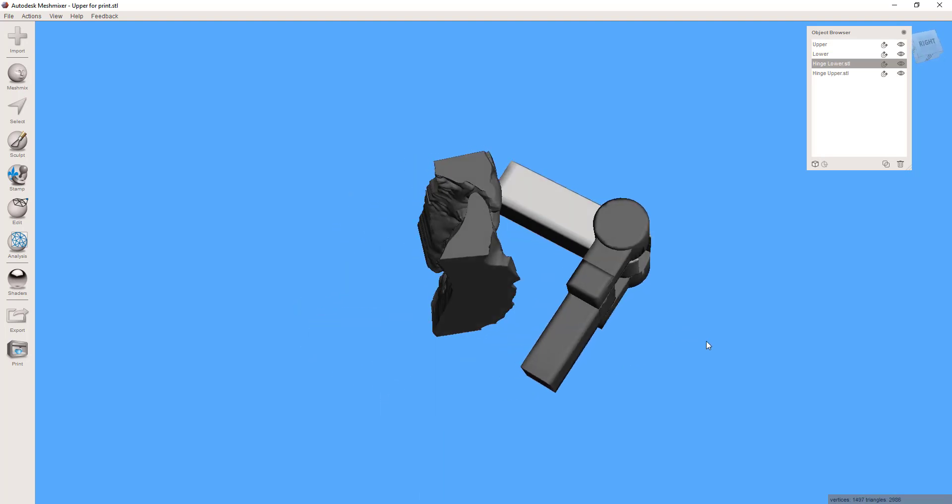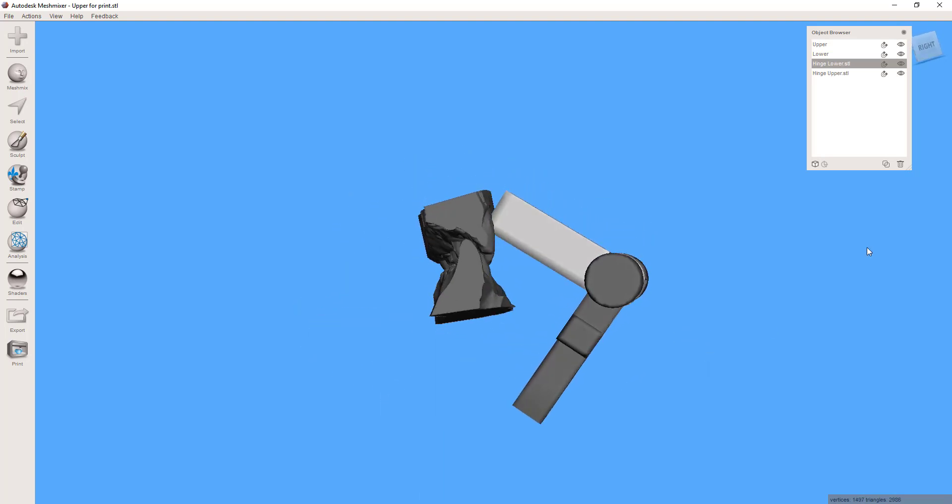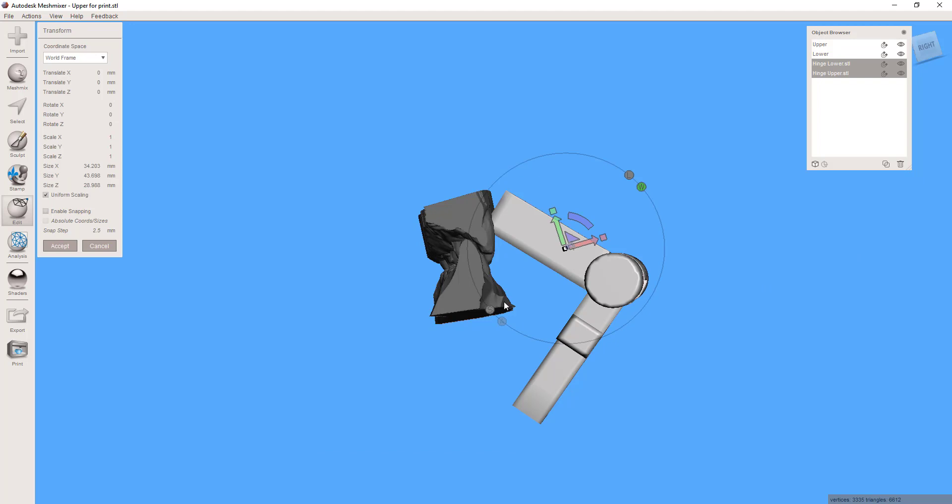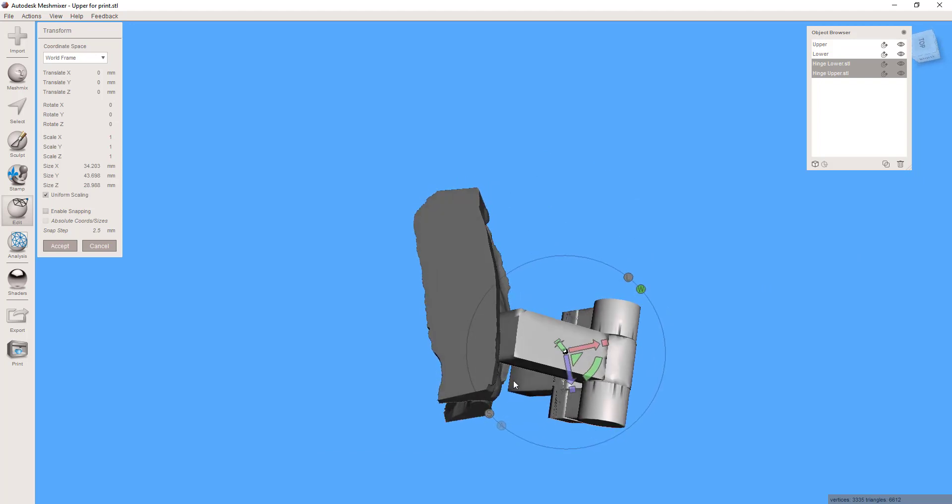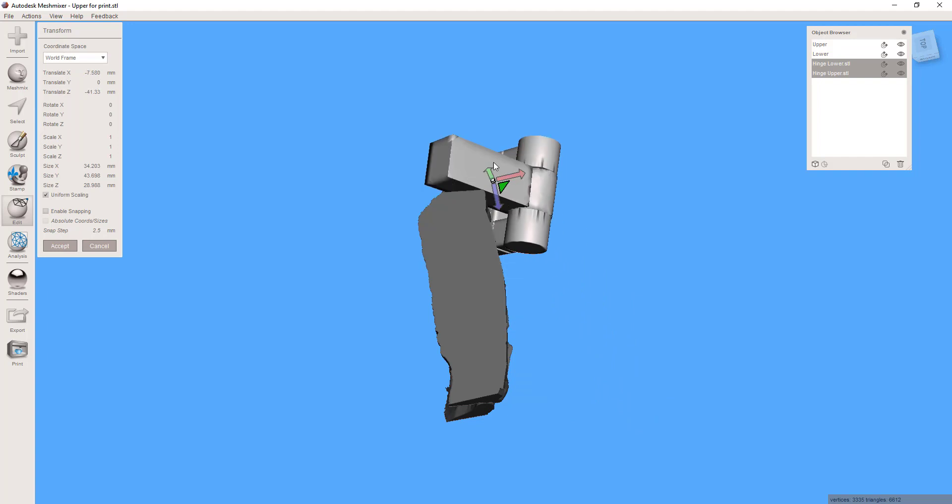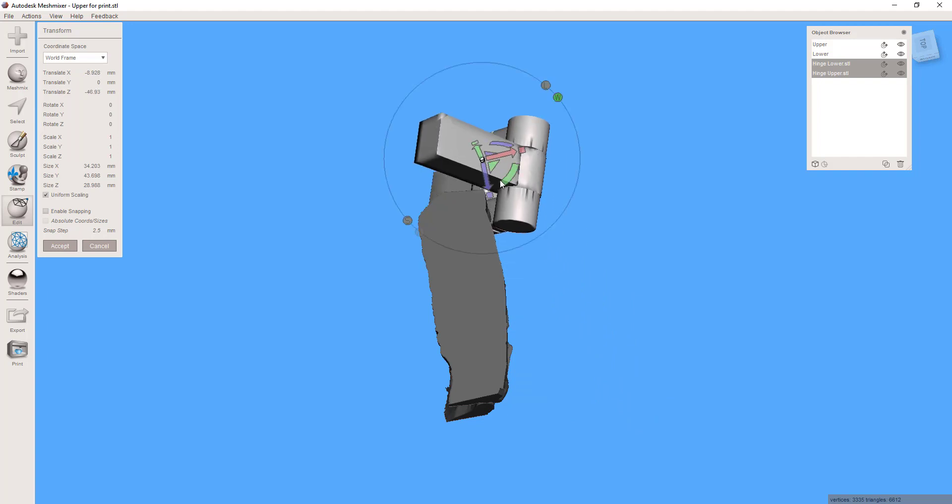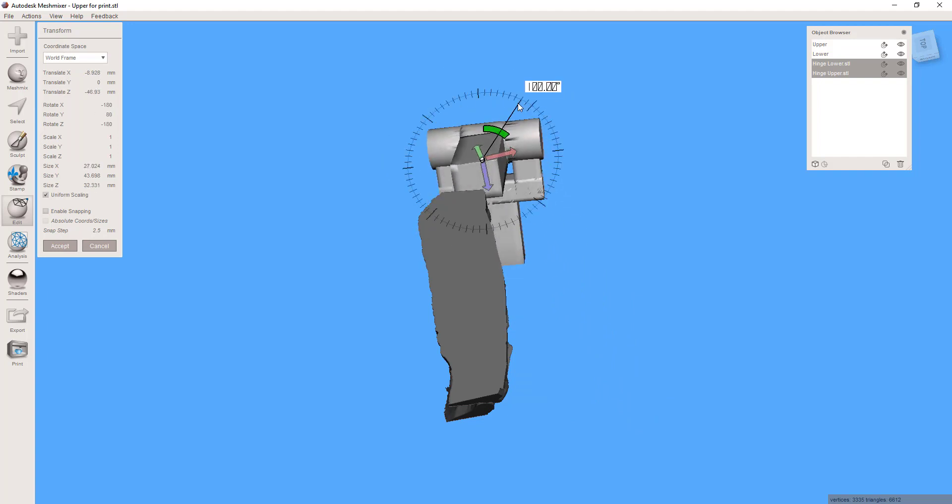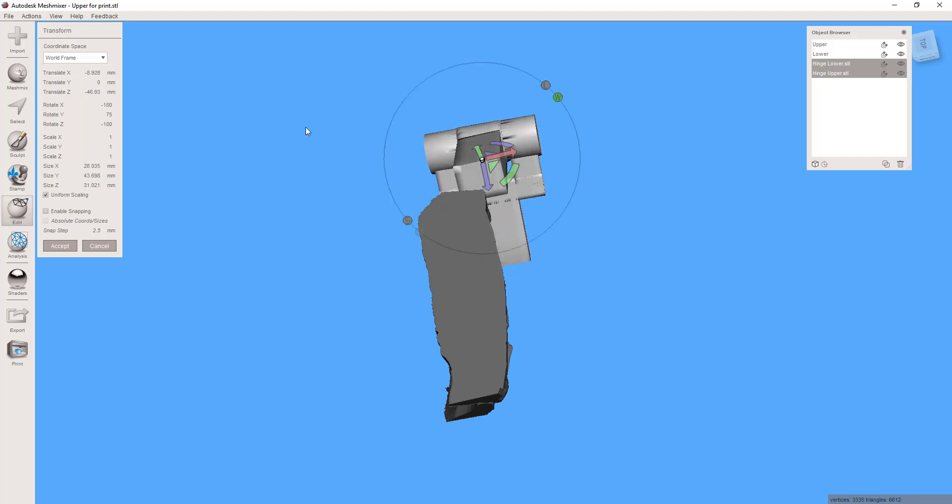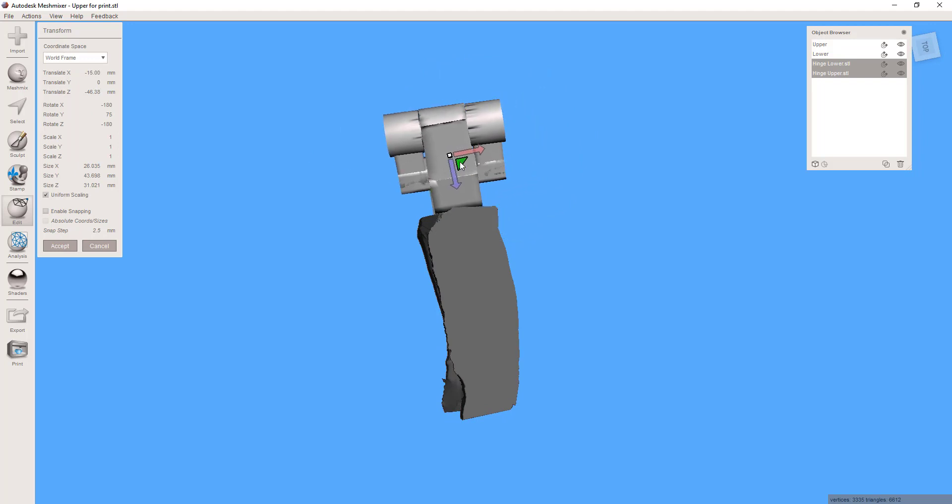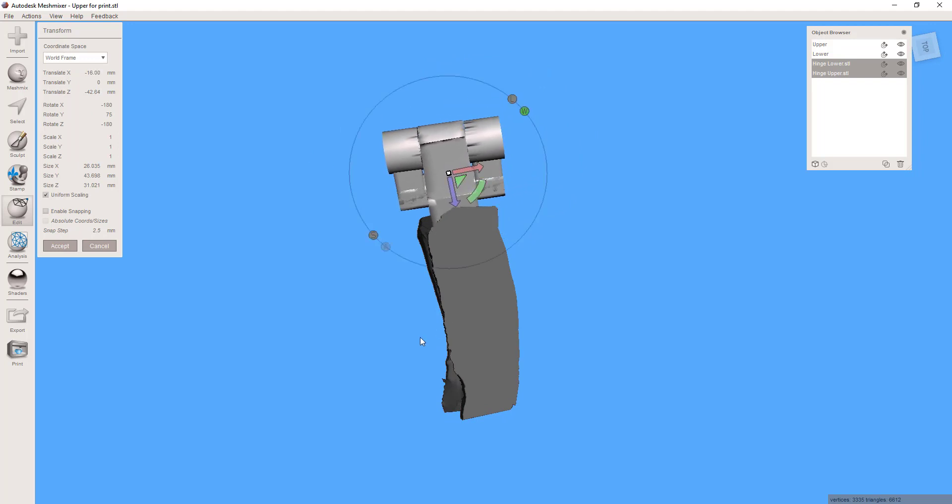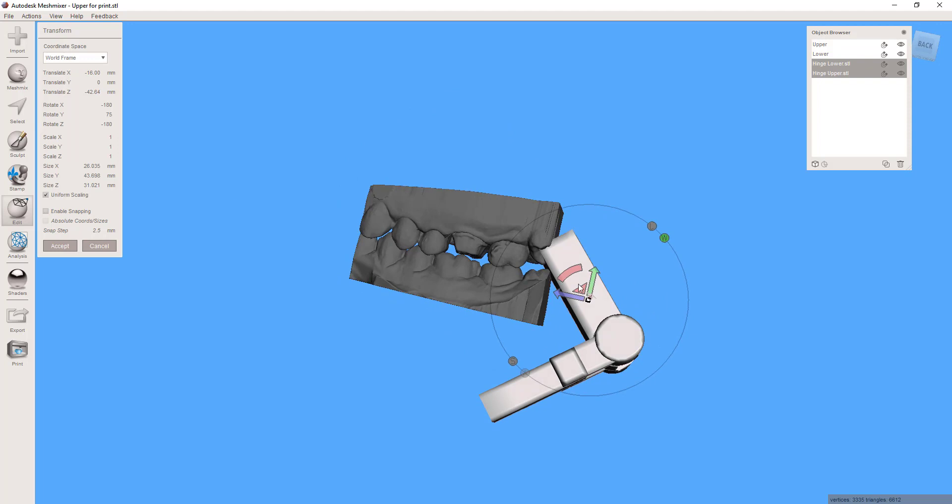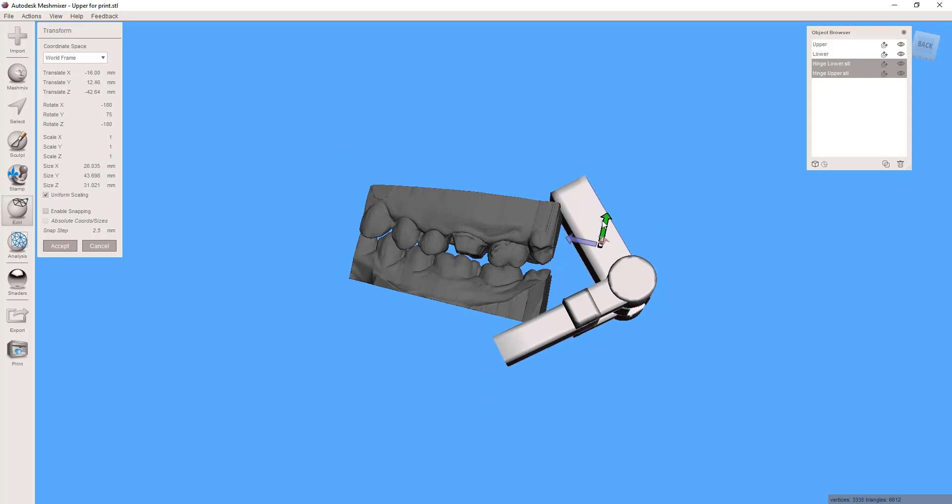Now the way to do that is you need to control select both the upper and the lower portion, and then once they're both selected you can push T for transform and we can move this into position. Very critical that you always make these movements with both portions simultaneously because otherwise you mess up their relative position to one another and then they snap together in a position which is not the same as what your occlusion should be.